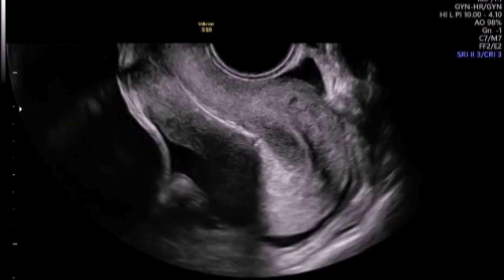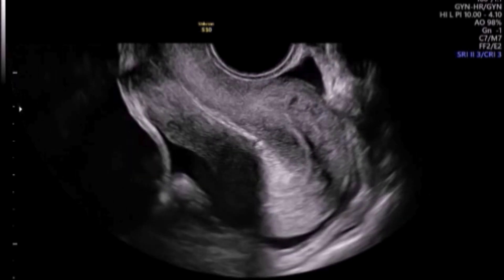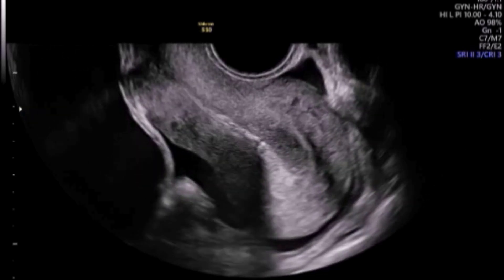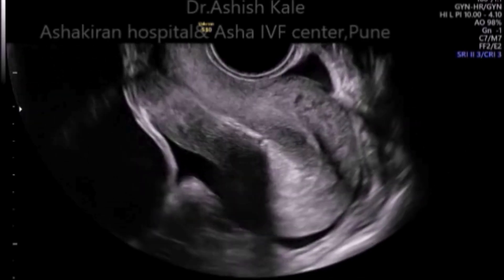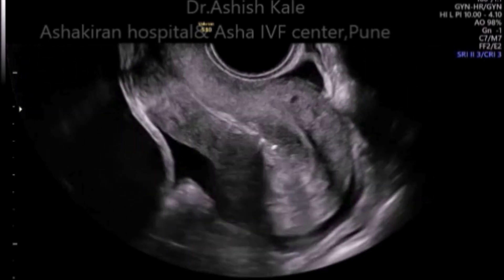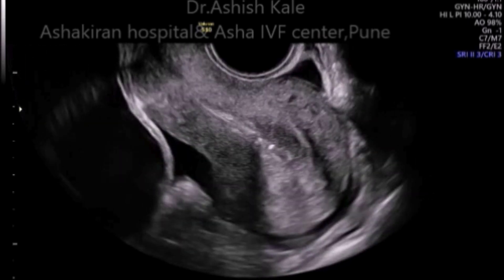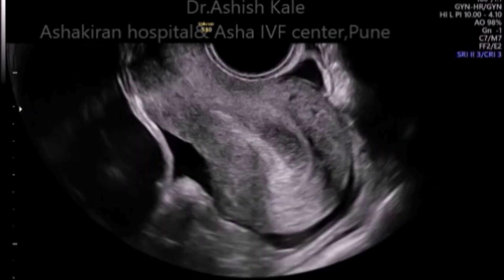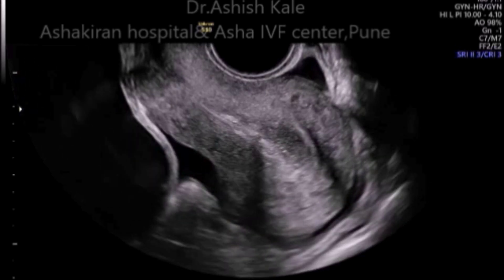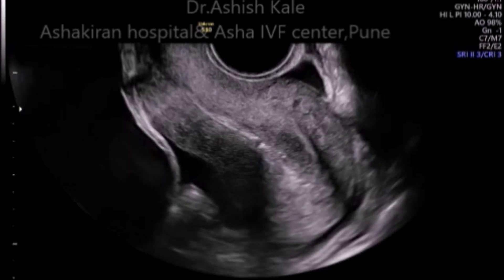The embryos are being deposited inside the uterine cavity without excessive manipulation. After the embryo transfer, we must check the inner catheter for any blood, and also check the outer catheter tip for any collection or blood. We use Cook's catheter for embryo transfer. Previously I was using a Sure-View, but Cook's catheter is better for negotiating difficult embryo transfers.